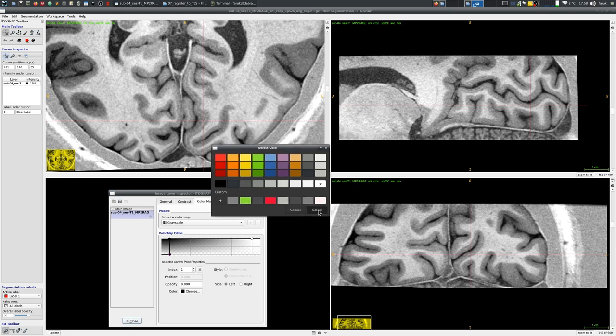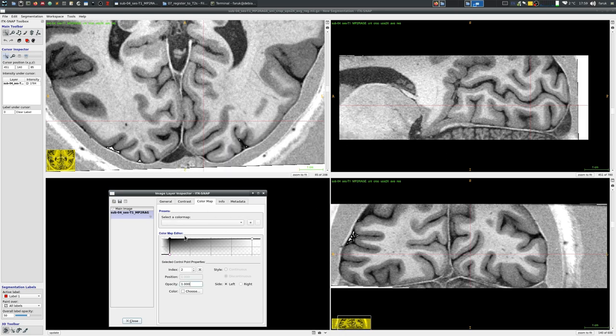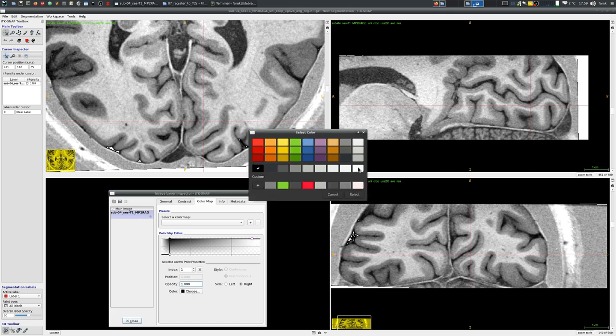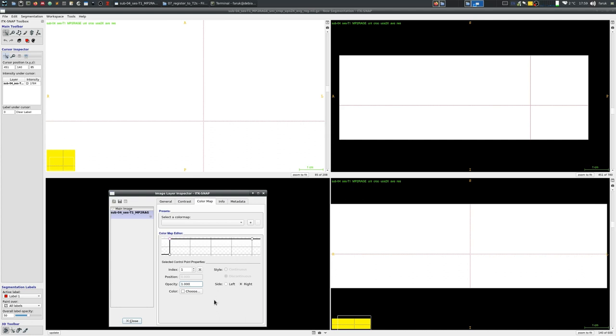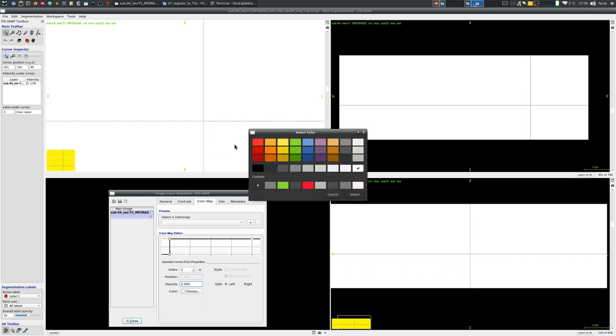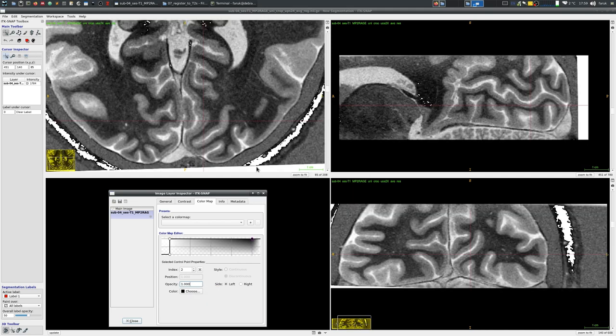Here I'm changing the first node from black to white. You saw everything become white. Now I go to the last point or node and then change it from white to black.